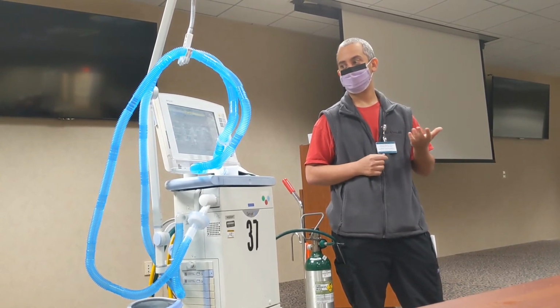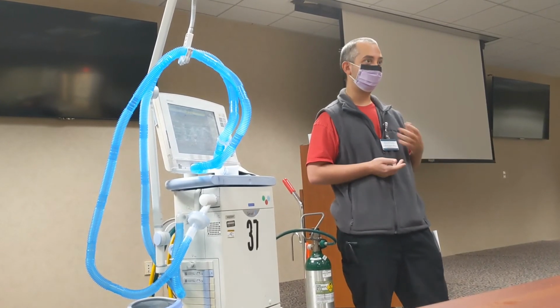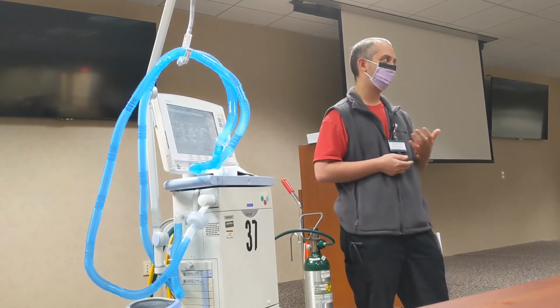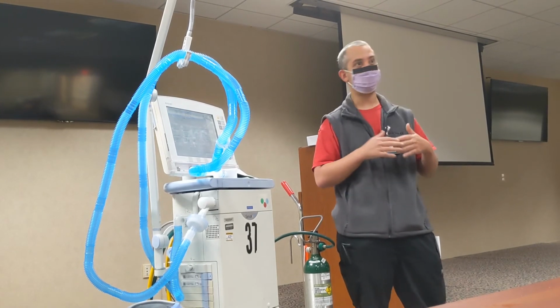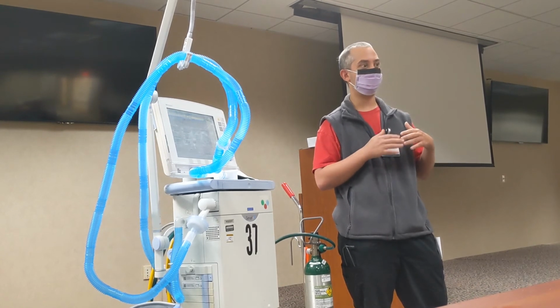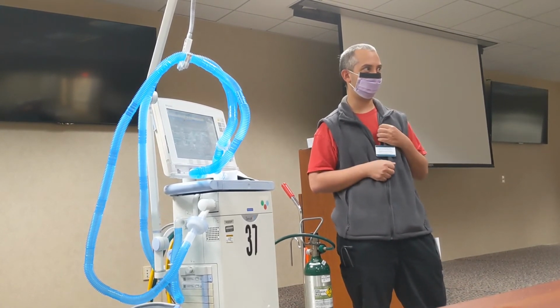Also, titrating, I personally like to come down on FiO2 first, and then once you get down to that 50% or so, that's when you'll start coming down on your P high, lengthening your T high to get it as close as possible to that CPAP level for further weaning.